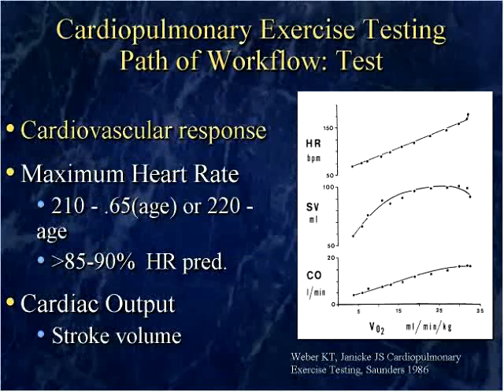As far as the cardiac response, there are a couple different formulas as far as what their predicted maximum heart rates are. But that can be helpful. You know, your predicted maximum heart rate's 180. You're only at 150 now. Keep on going. I want you to get up there. And those type of things as far as encouraging the individual to give you a good effort.